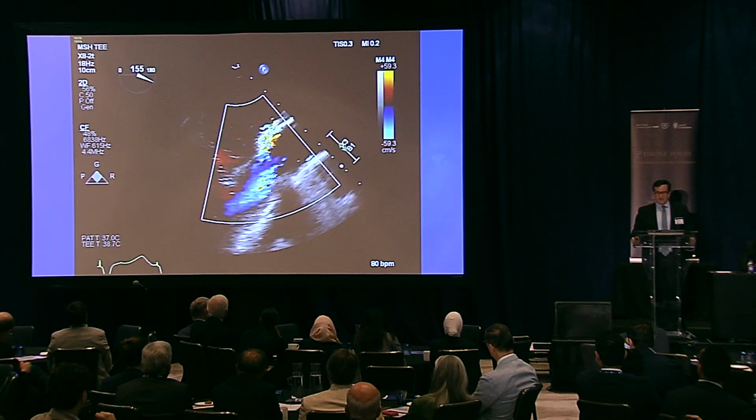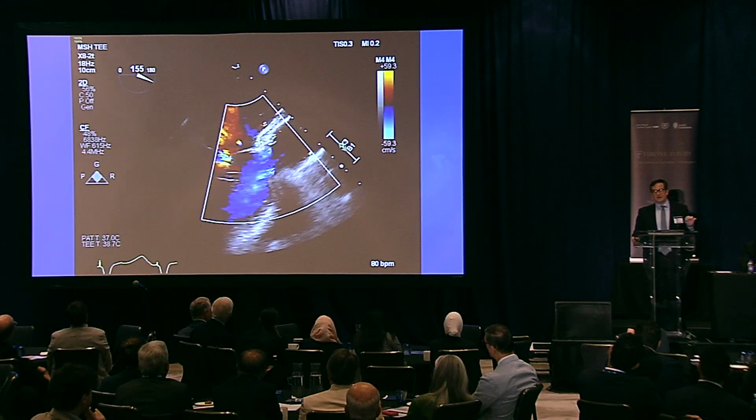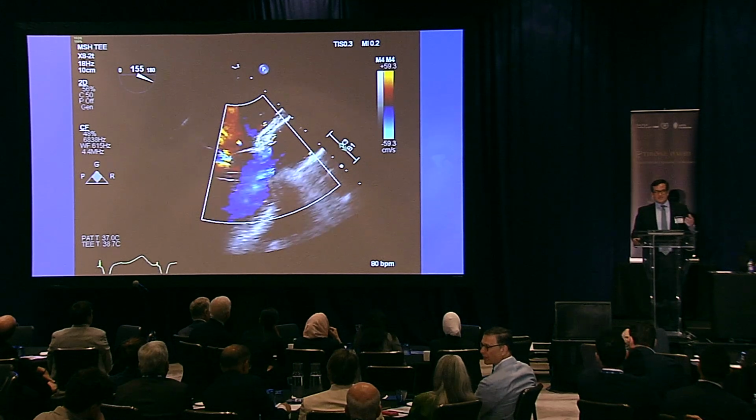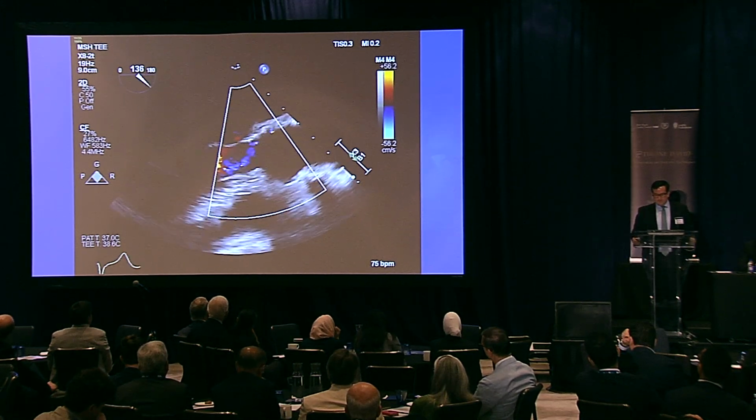But we waited. This is the worst condition right when you take the clamp off. You have all the pressure of the aortic cannula pushing against a totally empty ventricle that's decompressed, and it's all the pressure on the valve. So this is the worst it's going to look. You wait a few minutes.